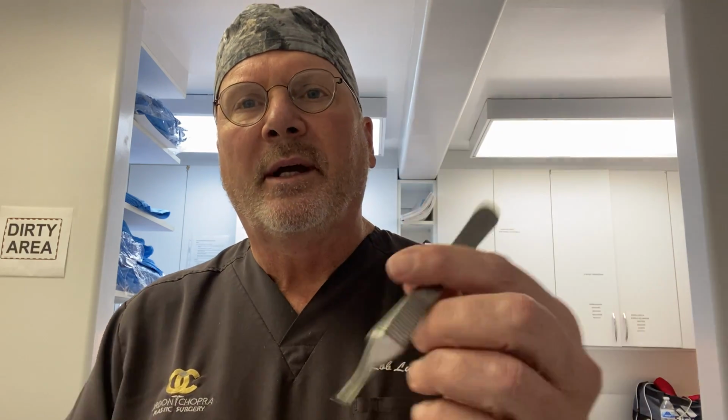But in surgery, after you figure out how to scrub and how to gown and glove and work your way around in the operating room, the proper etiquette, if you're asked to suture, if you grab the instruments incorrectly and you're not holding them properly, you're going to suffer long term, because for one thing, no one will let you do anything. They look at the way you grasp a forceps and you grasp it like this. But nobody holds a forceps that way. Everybody holds it like a pencil.